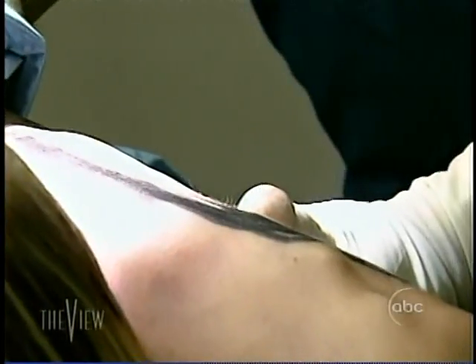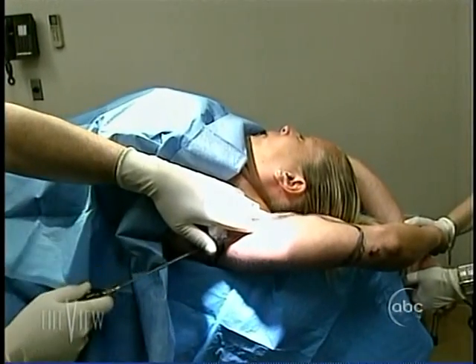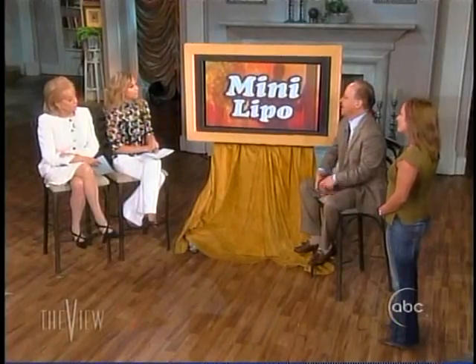It still looks tough on the body there. That's hard to watch. So this is, how long did this procedure take? Lunch. This was an hour, you said? It takes a little less than an hour. It takes about 20 minutes for the actual procedure, and then we do the local anesthesia. And then do you have to have your arms bound or something? We have a bandage on. We have people wear that for about a week or two.